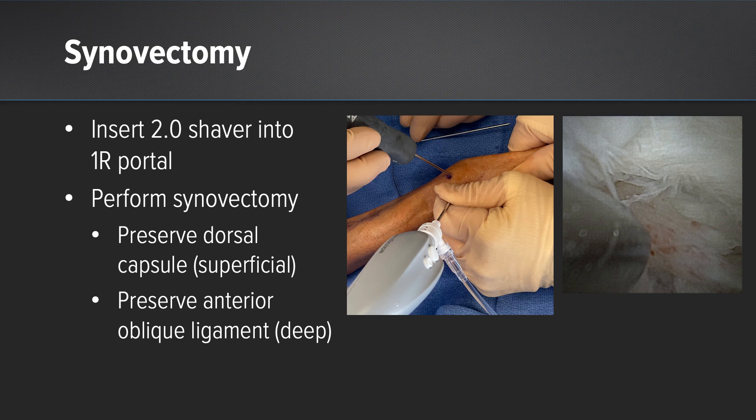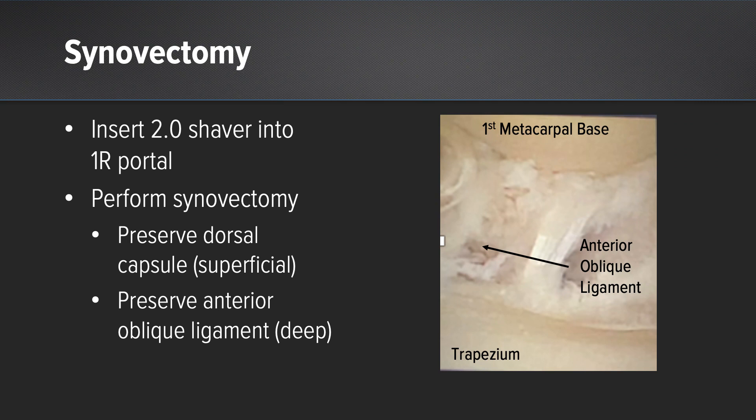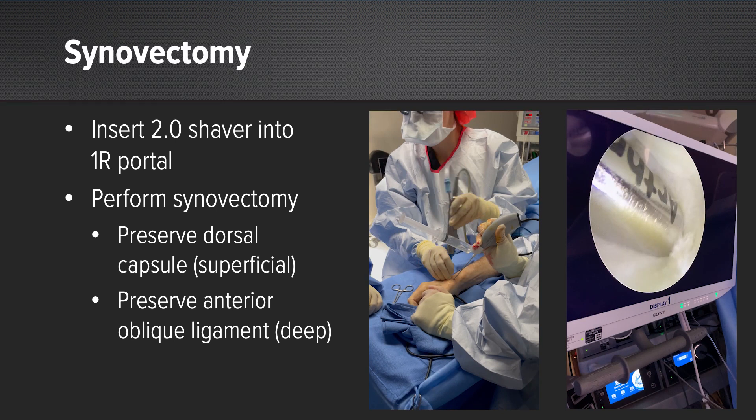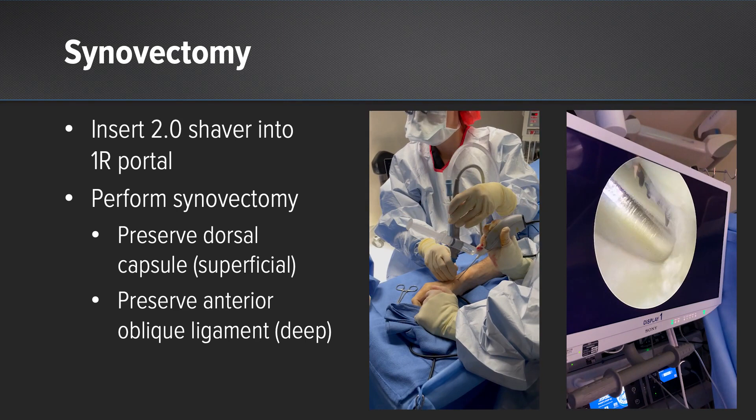Synovectomy can be performed under direct vision, as in this photo. Care is taken to preserve the dorsal capsule, as well as the anterior oblique ligament, as you can see here. This photo also shows arthritic changes in the metacarpal base as well as the trapezium. With the fluid on and the shaver on suction, a synovectomy can easily be performed of both the scaphotrapezial joint and the CMC joint, as you see in this video.